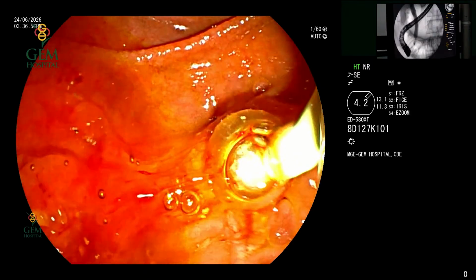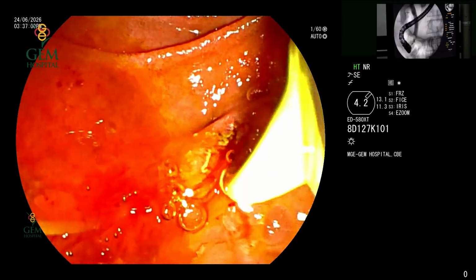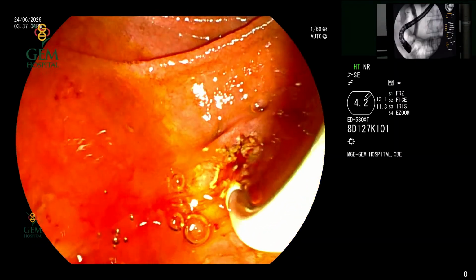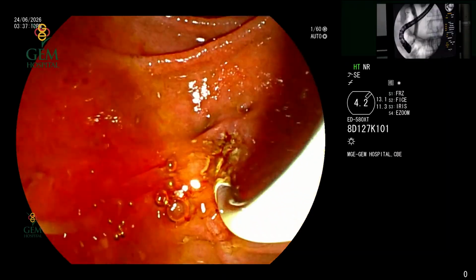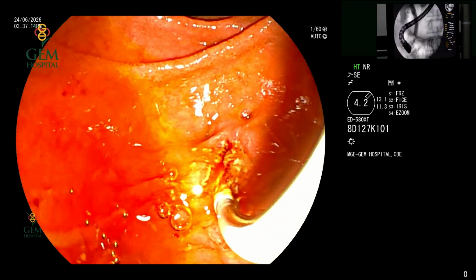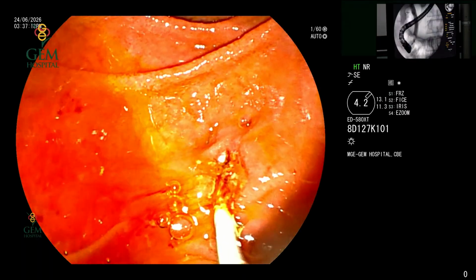Some more trace of possible filling defect. We have a small linear filling defect that we saw towards the distal CBD, just above the suspected stricture. So we are going towards another trawl to possibly seek clearance. The technician here is again injecting 2.5 cc in the extractor balloon.